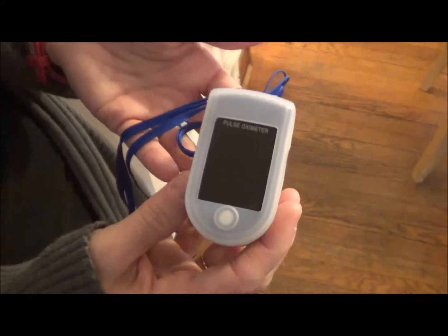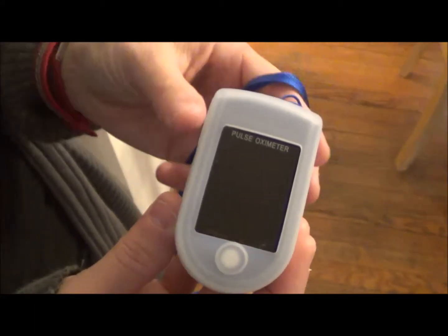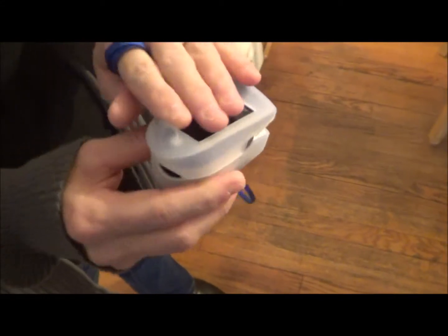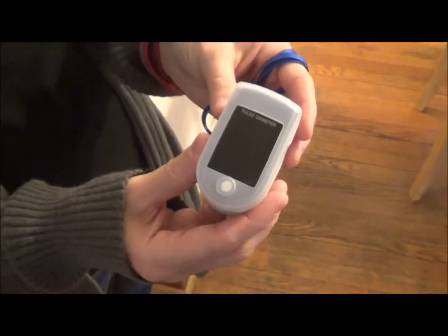It also measures your pulse or your heart rate. When you get this pulse oximeter, it comes with two AAA batteries that you place in the back. It also comes with a lanyard and a silicone cover that comes off, but that will add some protection to it.